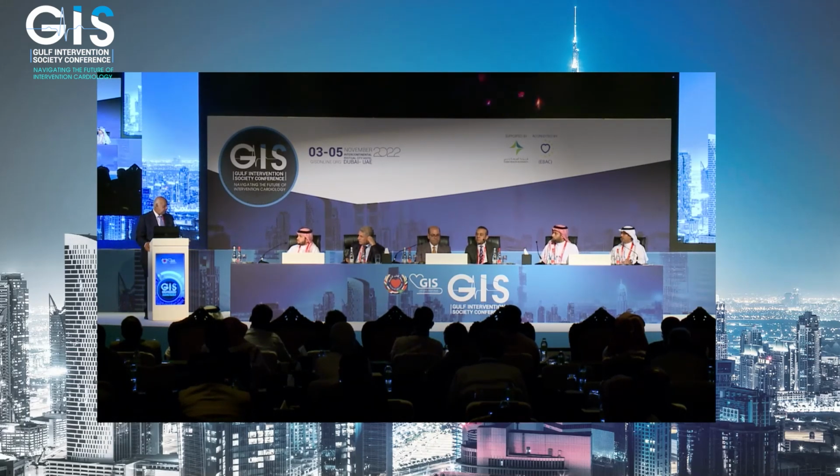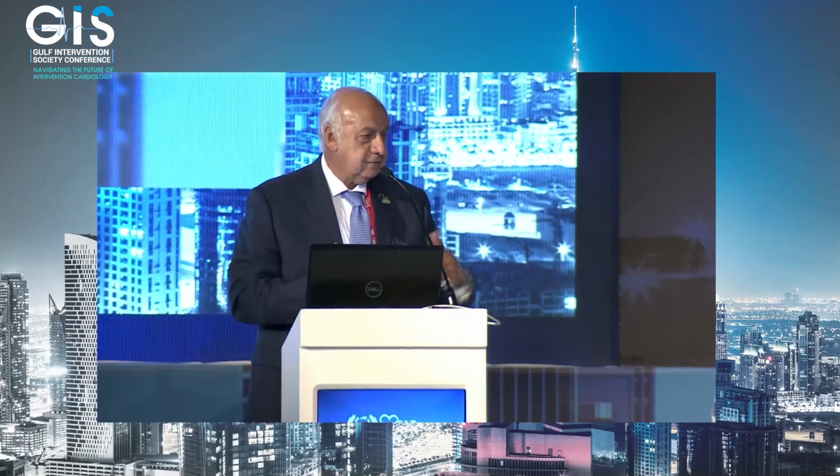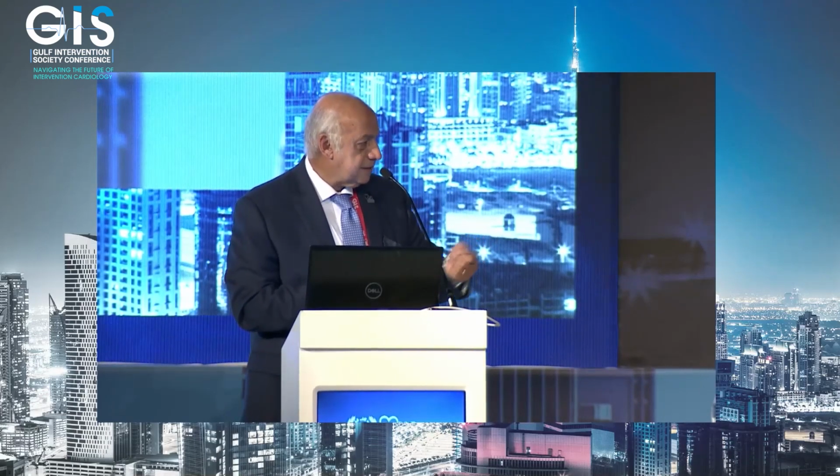I'm not thinking of going larger for the side branch. Usually when I'm doing kissing, I do alternating first, the side branch first, then the main, and then alternating. And then finally I go out with the side branch to the main vessel and do it with a higher pressure, for example not more than 20, 22, and then ending with 16 for the main branch and side branch.